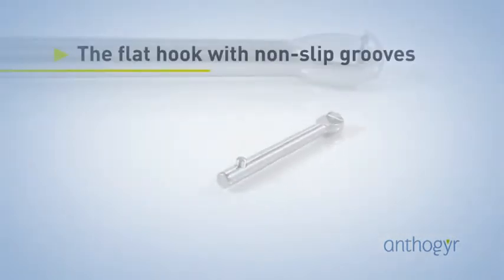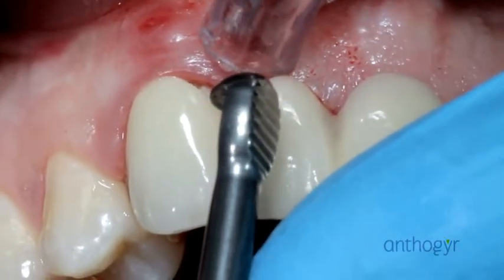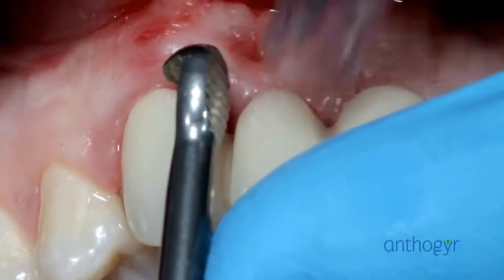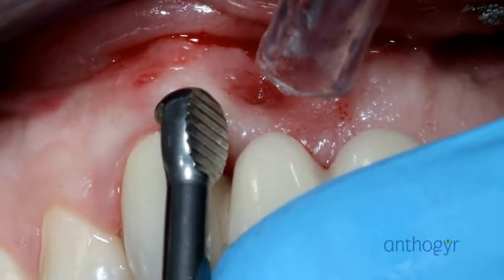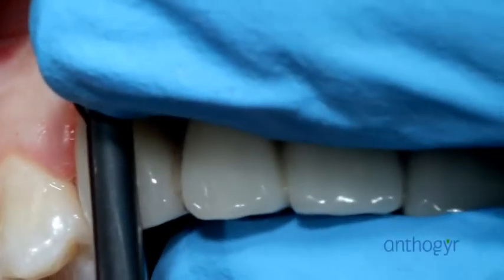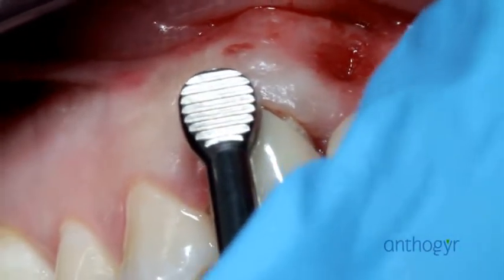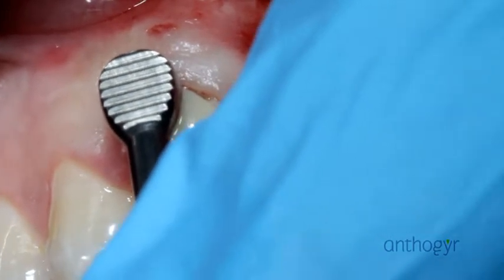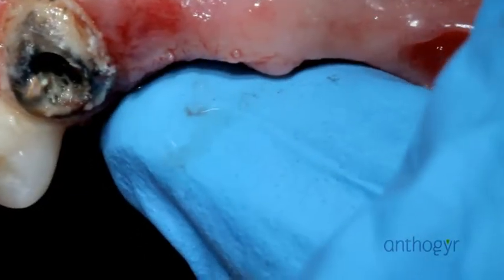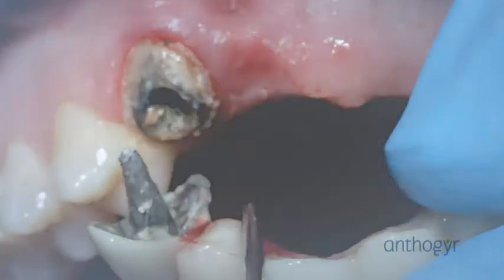This concerns the removal of a 6-element anterior bridge. The flat hook with non-slip grooves will be placed on the cervical vestibular ridge of 13 in order to apply traction in the tooth axis. To facilitate this, the hook has non-slip grooves that allow you to lean on the external side, thereby reinforcing the attachment on the cervical ridge of the crown. Once again, the crown's removed very easily and the anchorage remains intact.